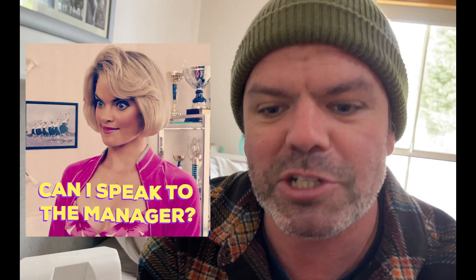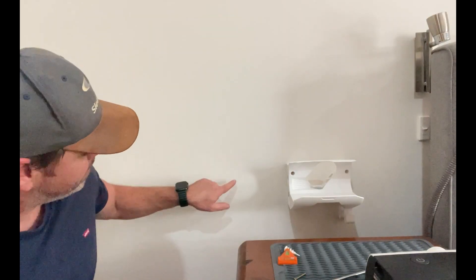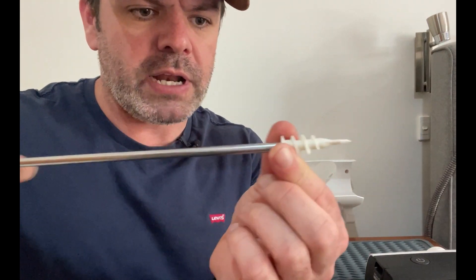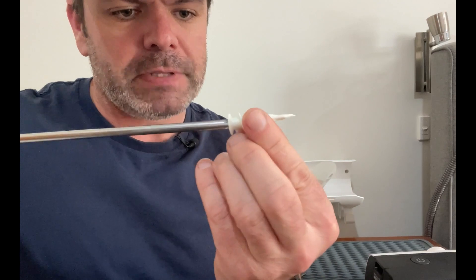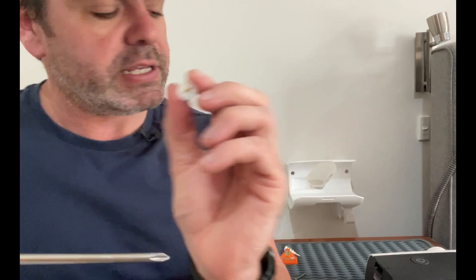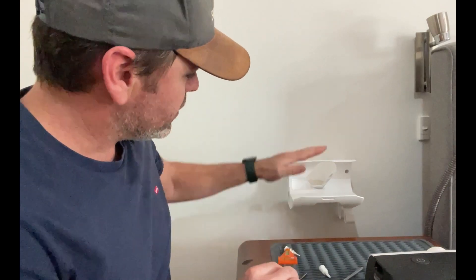Mum's not going to be too happy about that, is she? So once you've marked your little anchor points, you just grab this here and you push it straight into the wall nice and hard. And then you just screw it in so it's nice and flush. And once you've got these anchors in the wall, you can then screw in the wall mount.